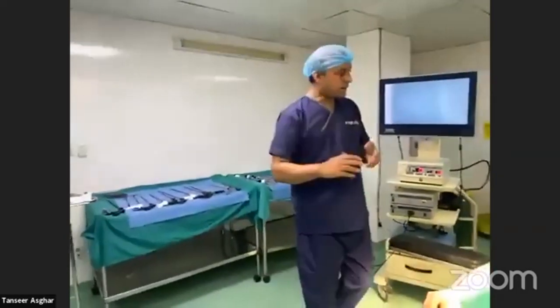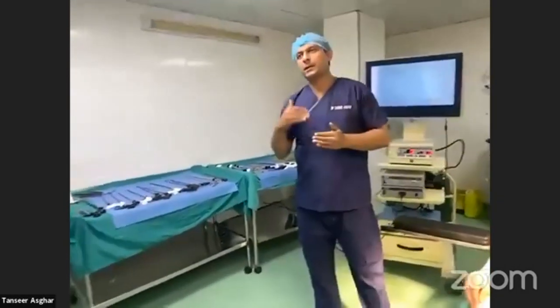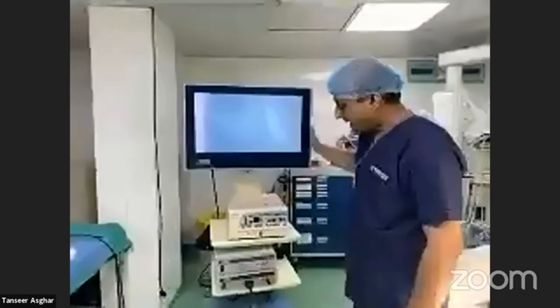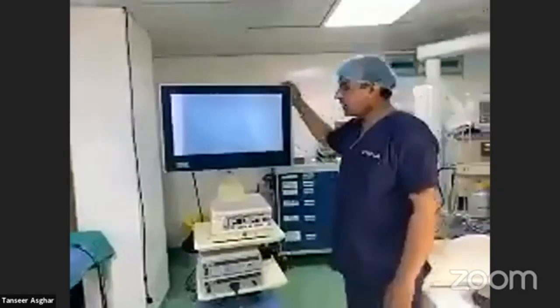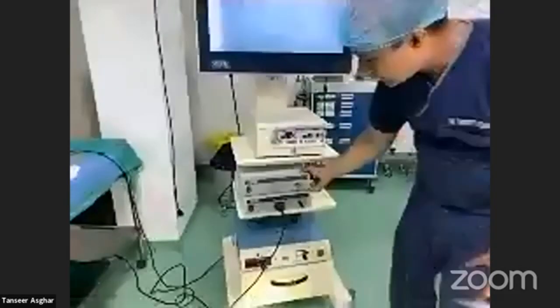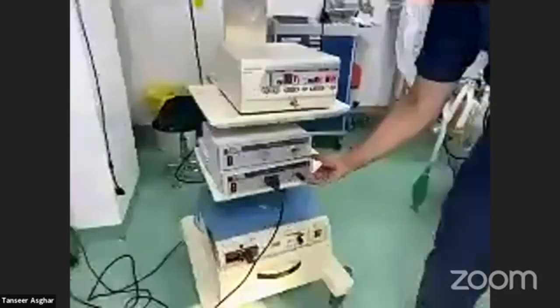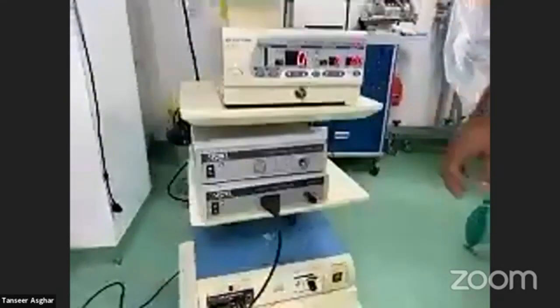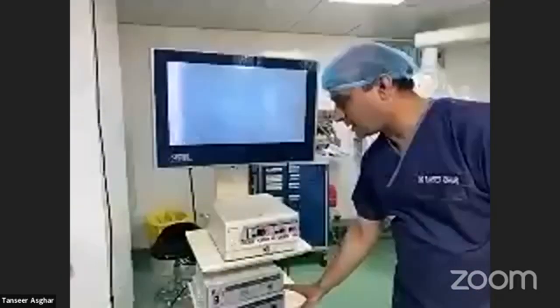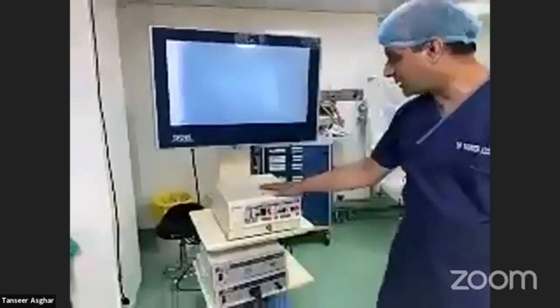This was a brief account of patient positioning, and we can discuss it further in the Q&A. Now I will be describing the laparoscopic stack — the lap tower. Here you can see the screen or monitor, the insufflator, the light source, and the camera CCU or camera unit.